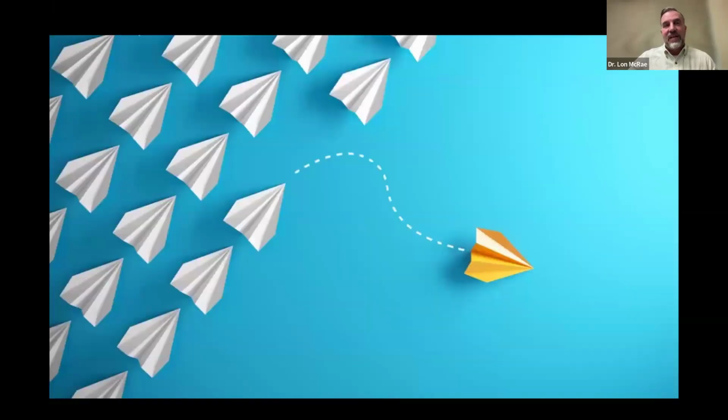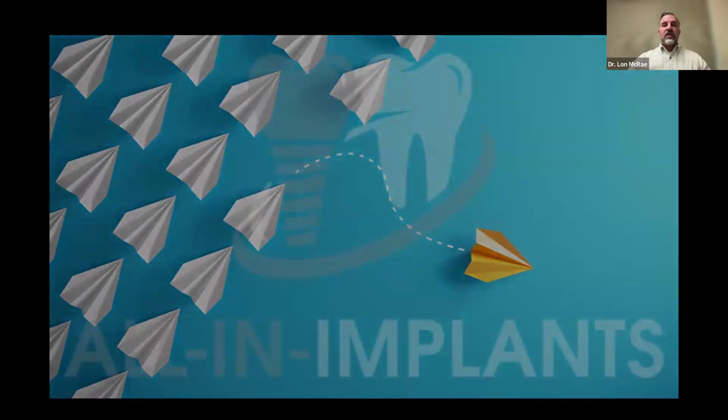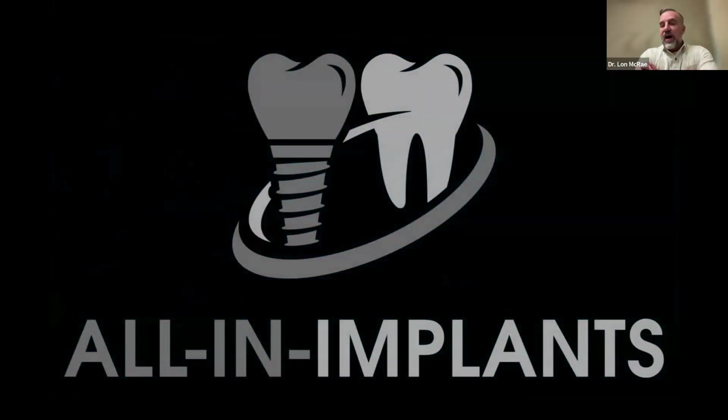But again, can we take a paradigm shift and say, okay, here's what we are going to do. We're going to do it a different way. Can we be able to not have all of this loss of bone, both from the buccal and from the horizontal and the vertical? Is that possible to do? So this is where the All-in implant concept has come up.